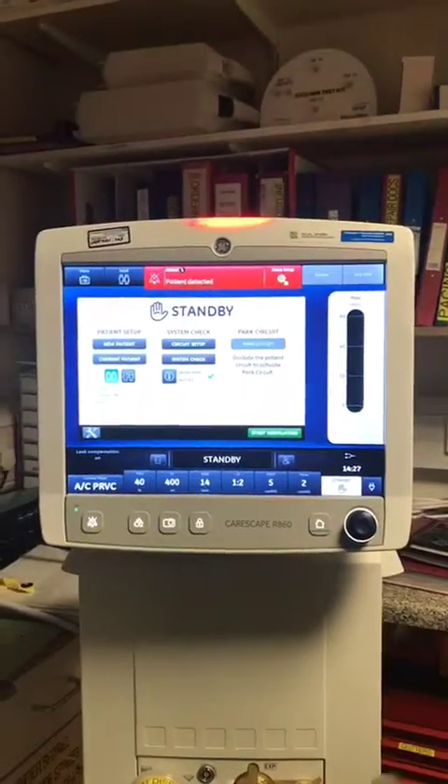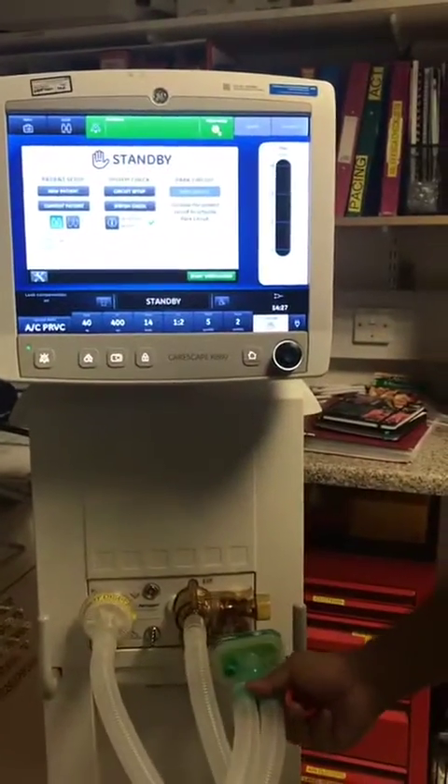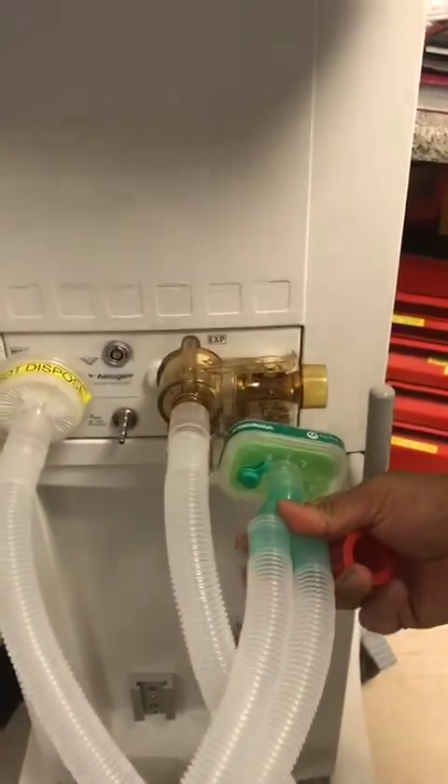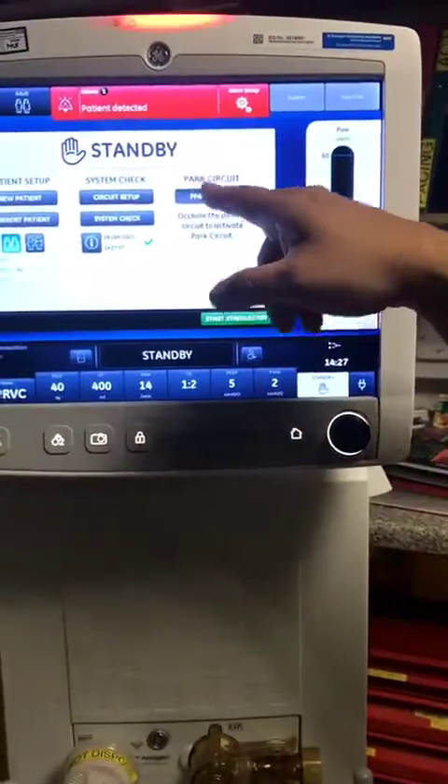After it's done that, you can park the circuit on the ventilator if you like. Just press park.